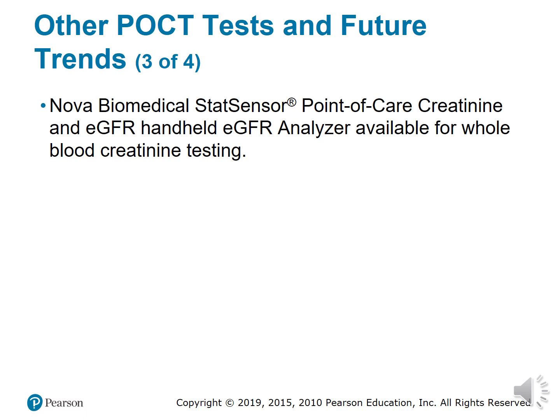The Nova Biomedical StatSensor point of care creatinine and eGFR handheld analyzer is available for whole blood creatinine testing. There again, it can test within minutes versus us drawing for creatinine levels.